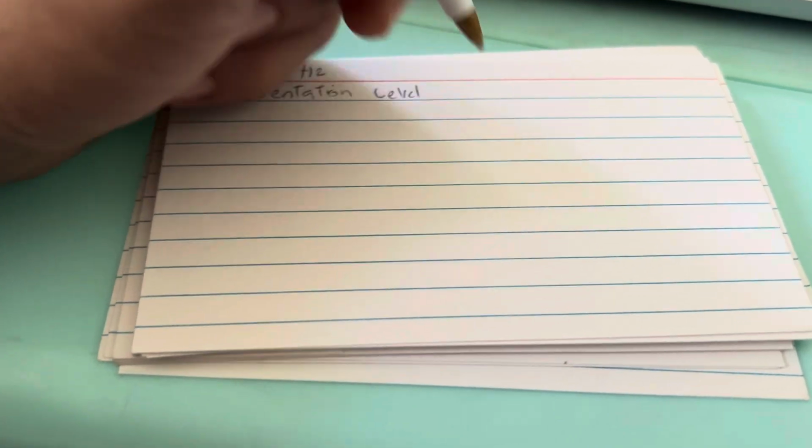At 4000 hertz, we're going to try 4000 hertz, right? And what I like to do is make a little table. First I'm going to write presentation level, then response, and then next step.